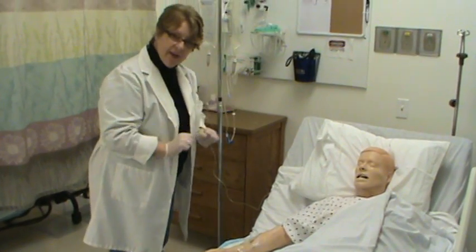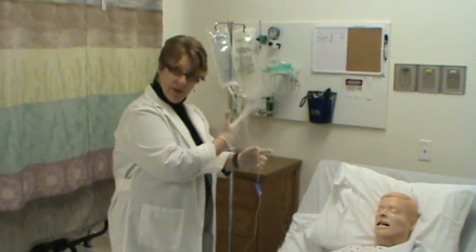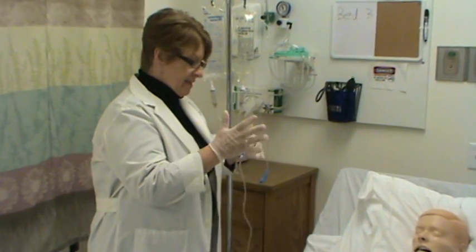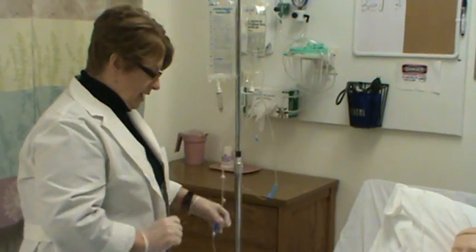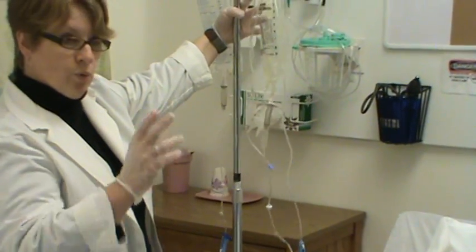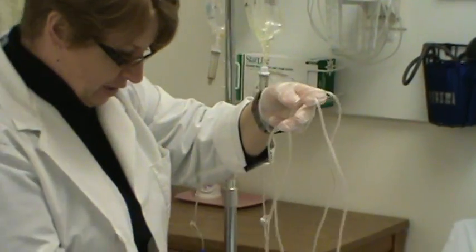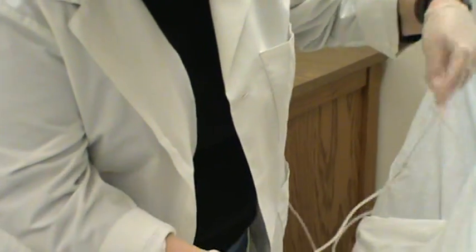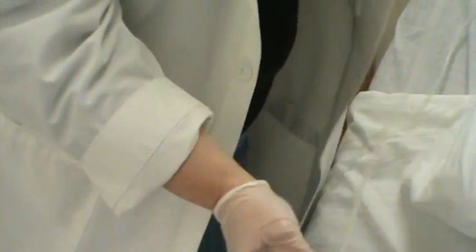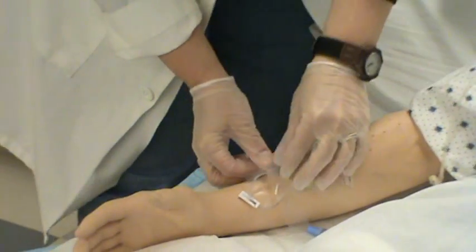So I've got my gloves on, and this is our bag that is arguably infusing into the patient. So what I'm doing is clamping it closed because I'm getting ready to discontinue it. And then we would be hanging the new bag that you would have brought into the room. So let me bring this down here near the patient. And I'm trying to be aware of showing you these things on the video, keeping my hands out of the way. So this is going to be our new tubing. This is our old tubing.